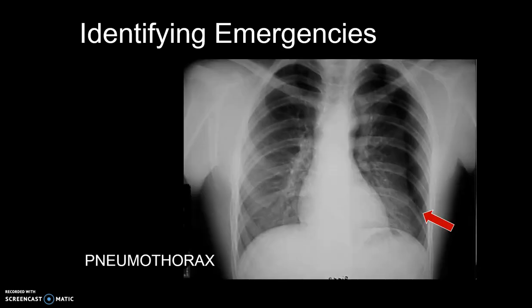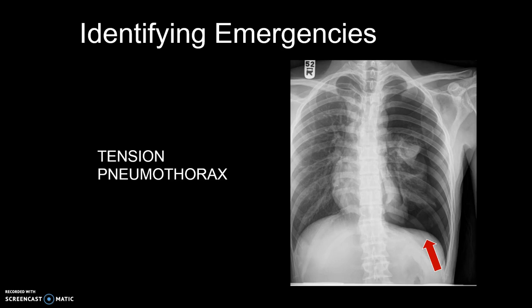A pneumothorax can be often difficult to see. The classic appearance is of a pencil-thin line which represents the lung's edge. You can see the thin pencil line here, but the heart has shifted, which indicates there is tension with this pneumothorax. This patient needs a chest tube very quickly.